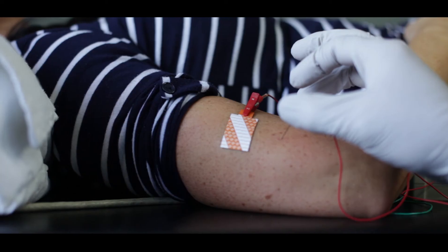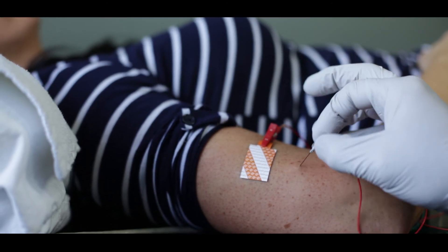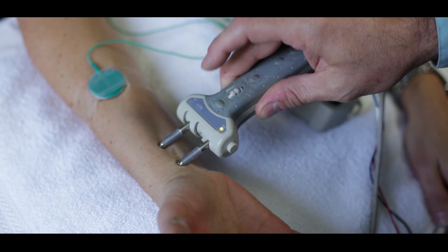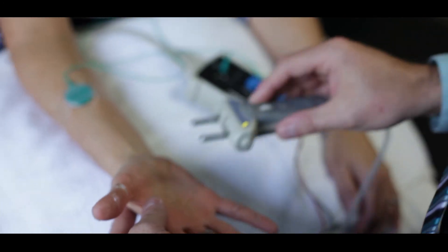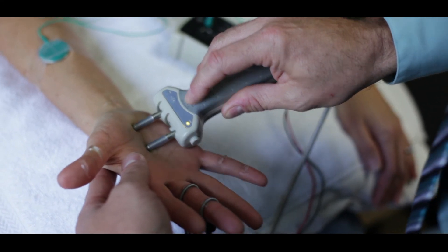When patients are referred to our clinic for electrodiagnostic testing, testing usually takes about 45 minutes to one hour. There is a little bit of discomfort associated with testing, but there are really no side effects. Patients typically can resume their normal activities that day, and we provide the results of their testing the same day.